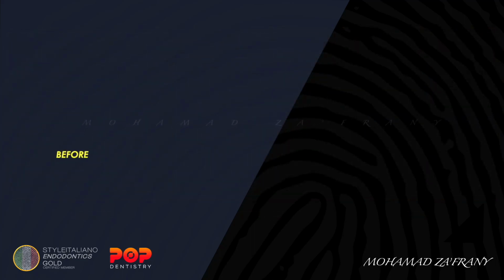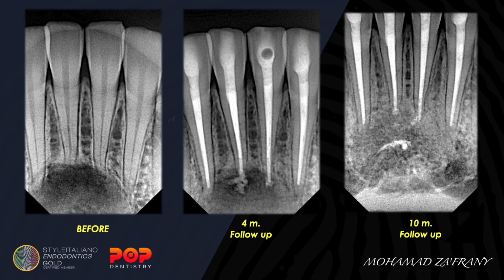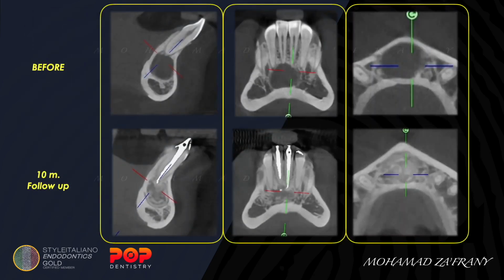And here is the case after treatment. Canals were obturated with bioceramic sealer and gutta-percha. And we can see here that within 10 months, there is very nice healing of the big lesion and hard tissue formation to fill the defect. And this is the 10-month CBCT follow-up.